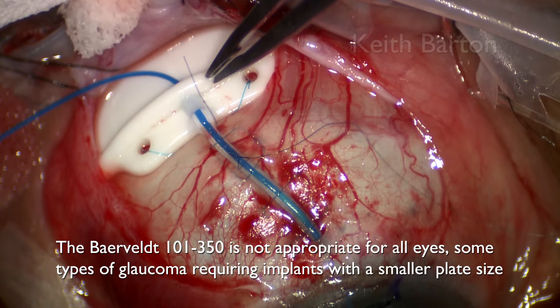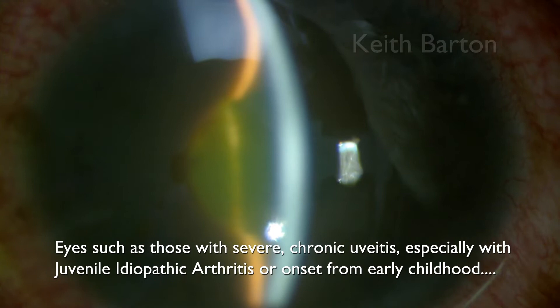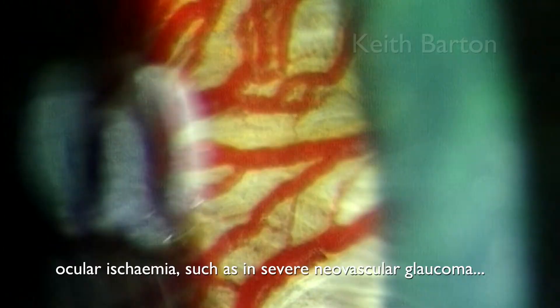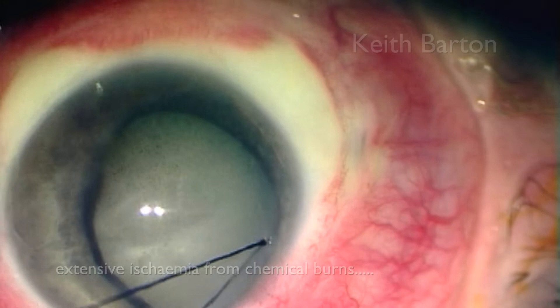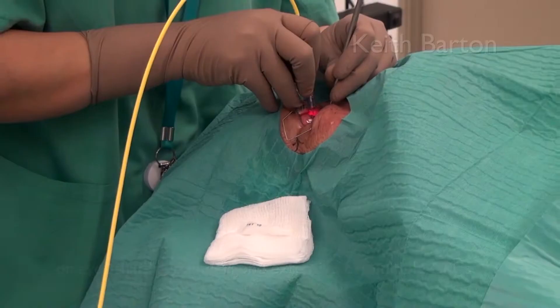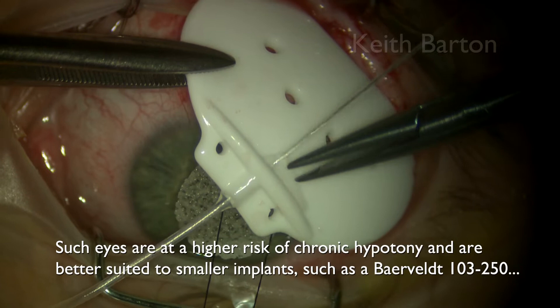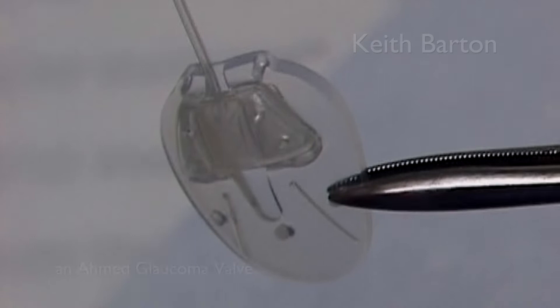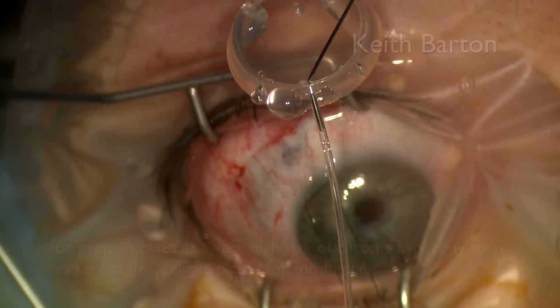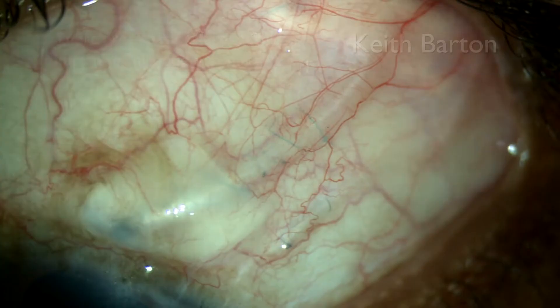The Baerveldt 101-350 is not appropriate for all eyes. Some types of glaucoma require implants with a smaller plate size — eyes such as those with severe chronic uveitis, especially with juvenile idiopathic arthritis, ocular ischemia such as severe neovascular glaucoma, extensive ischemia from chemical burns, or eyes that have undergone extensive or multiple CPCs. Such eyes are at a higher risk of chronic hypotony and are better suited to smaller implants such as the Baerveldt 250 or an Ahmed glaucoma valve, or even in cases of very severe JIA or other cases at high risk of chronic hypotony, a single-plate Molteno implant.